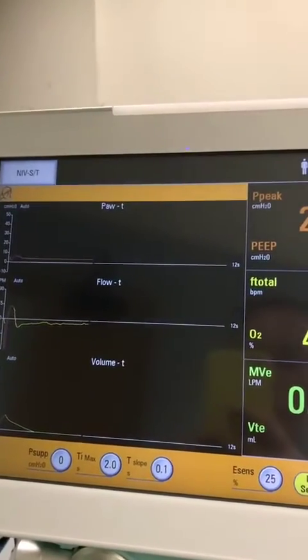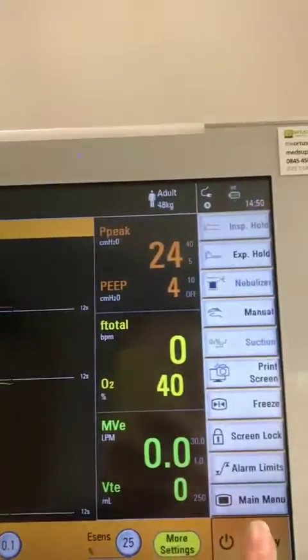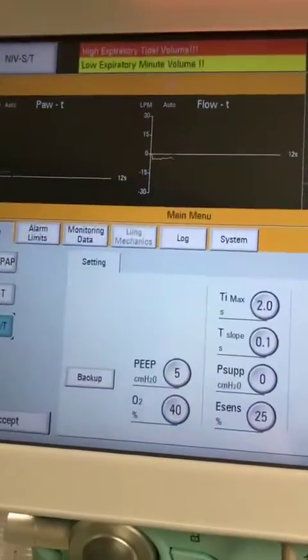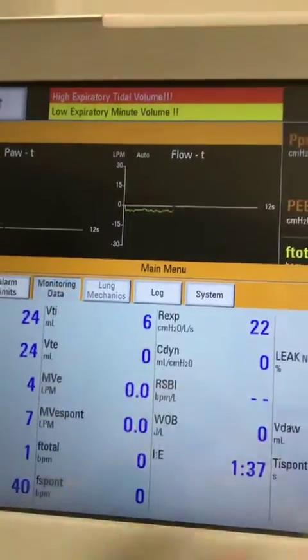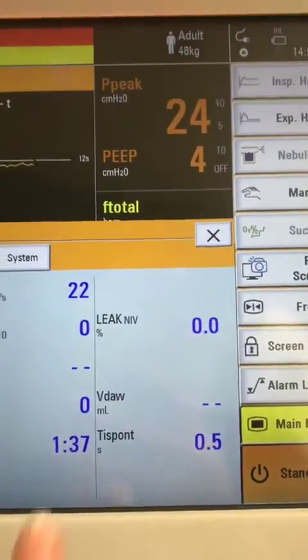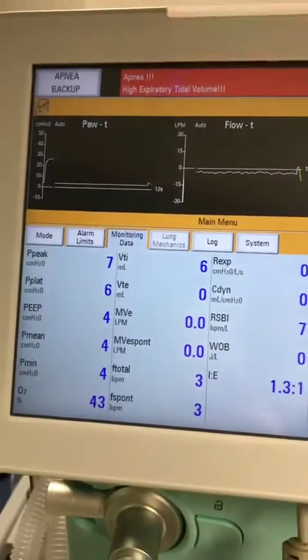From here you'll be able to look at leakage. If you go into your mode button or main menu — they both bring up the same screen — then go into monitoring data, you'll see you have a leak NIV percentage, as well as other parameters.